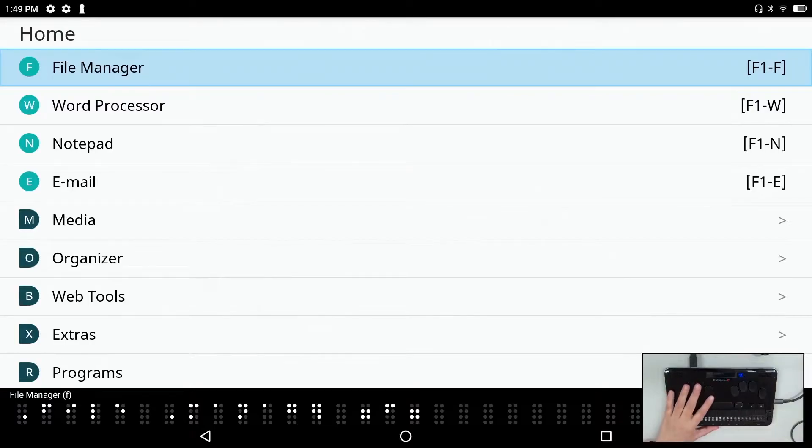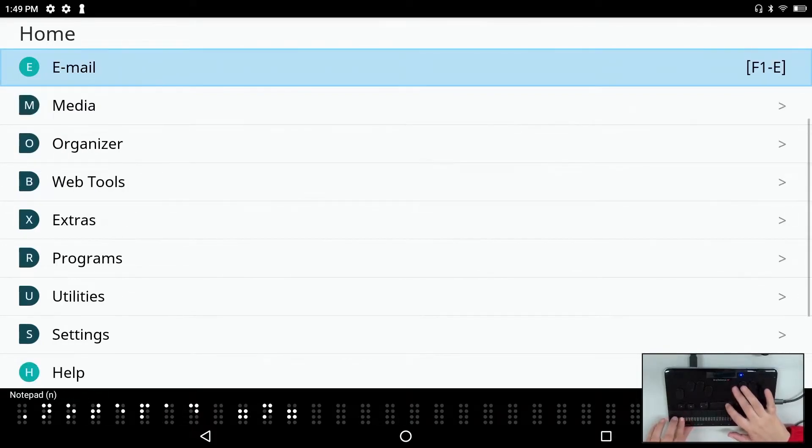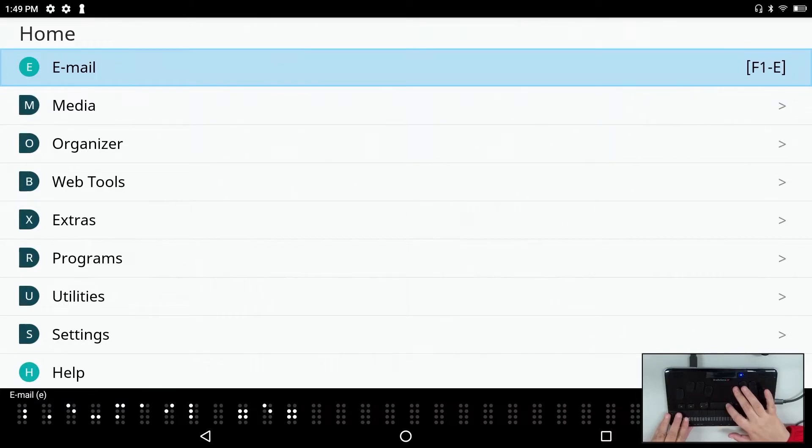The menus look very much like traditional BrailleSense menus, but don't let that fool you. We have our file manager, word processor, notepad, and email — we have now combined the email and exchange email applications into one.